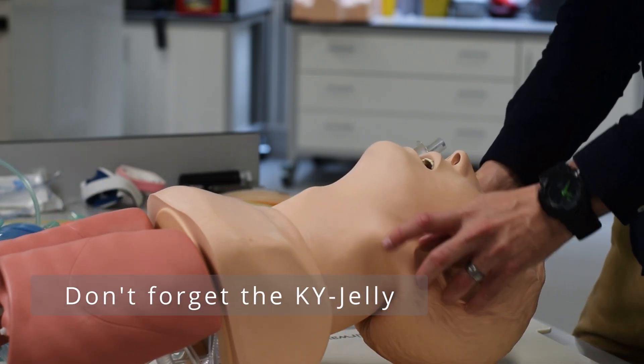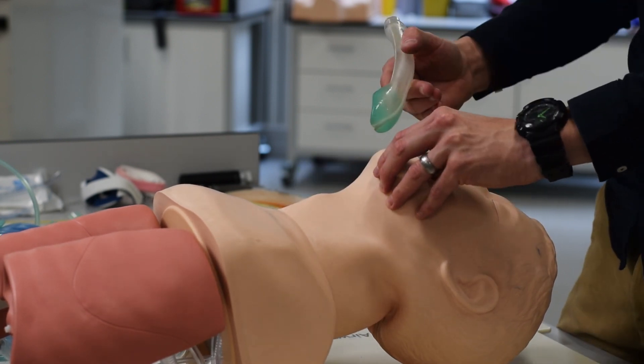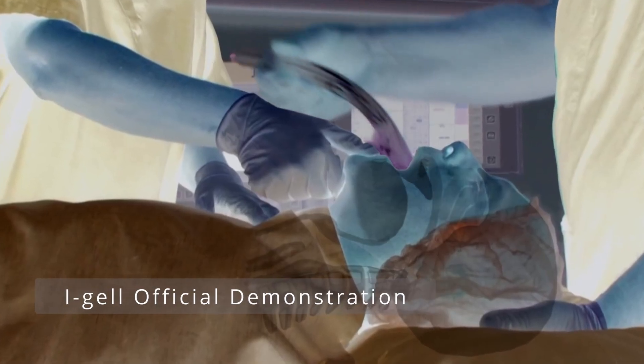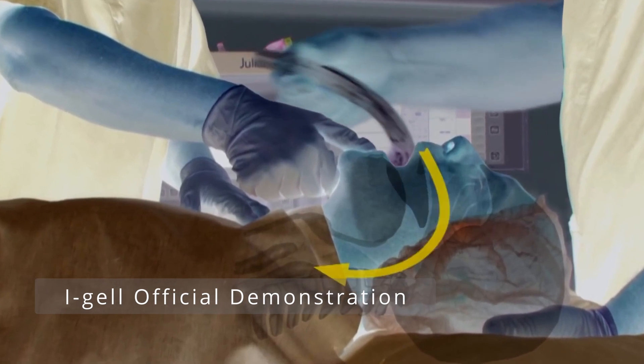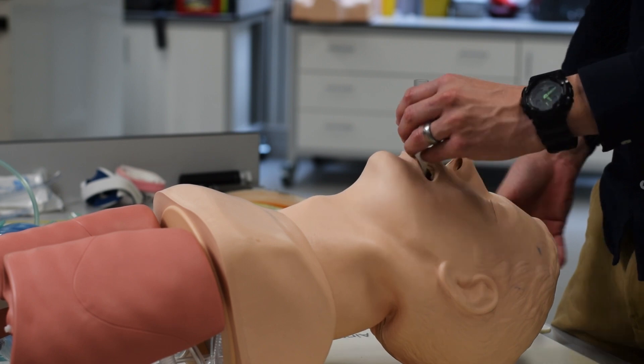What you want to do is a head tilt and chin lift if you can — obviously not in trauma. Slide the device down the hard and soft palate of the mouth. Once it's in the mouth, slide it down the back, and once you can't slide further, apply pressure.